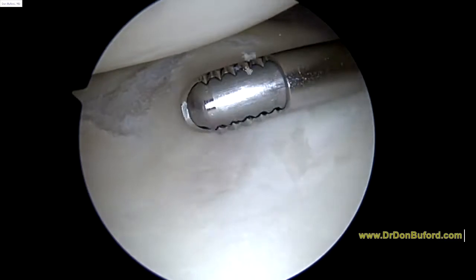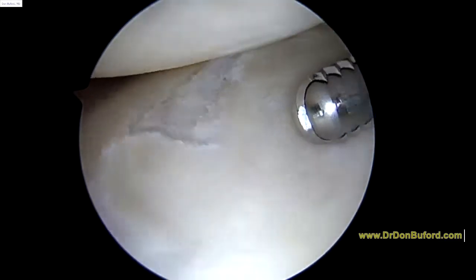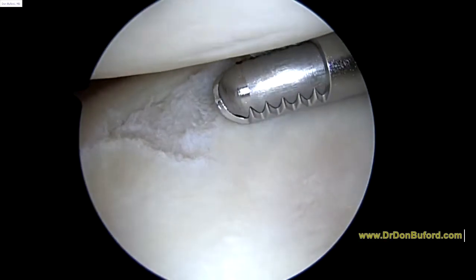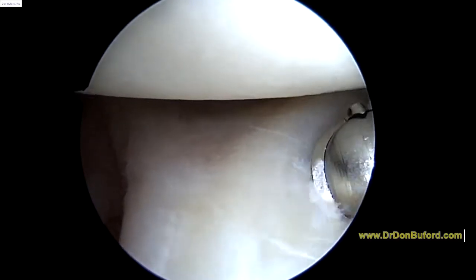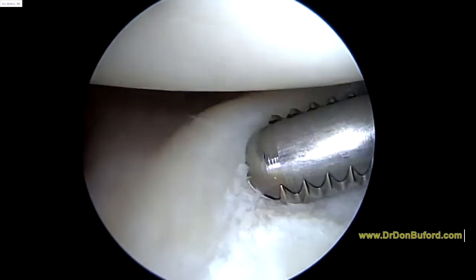So let me back up and give you the overall view. You can see it's kind of the bottom anterior — this is the middle of the glenoid, this is the bottom of the glenoid, the inferior aspect. So it's kind of the inferior anterior aspect of the glenoid, and there you can see the anterior band of the inferior glenohumeral ligament.